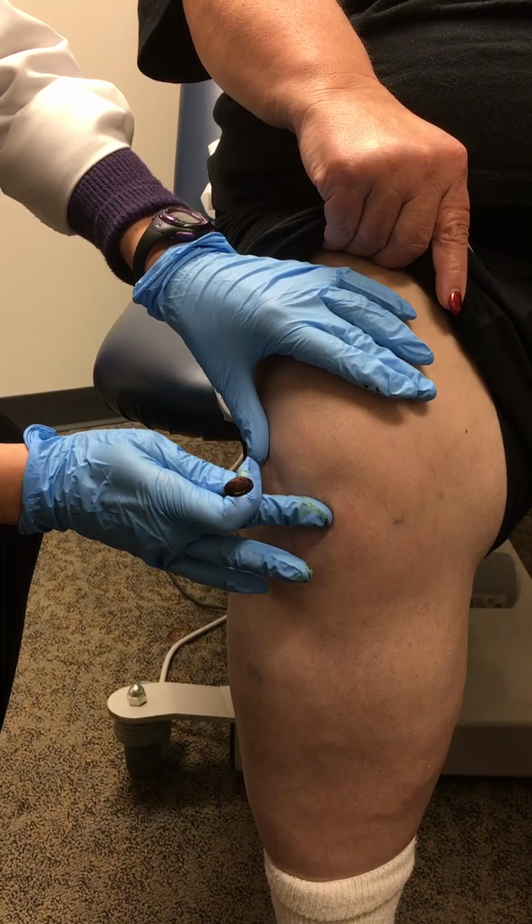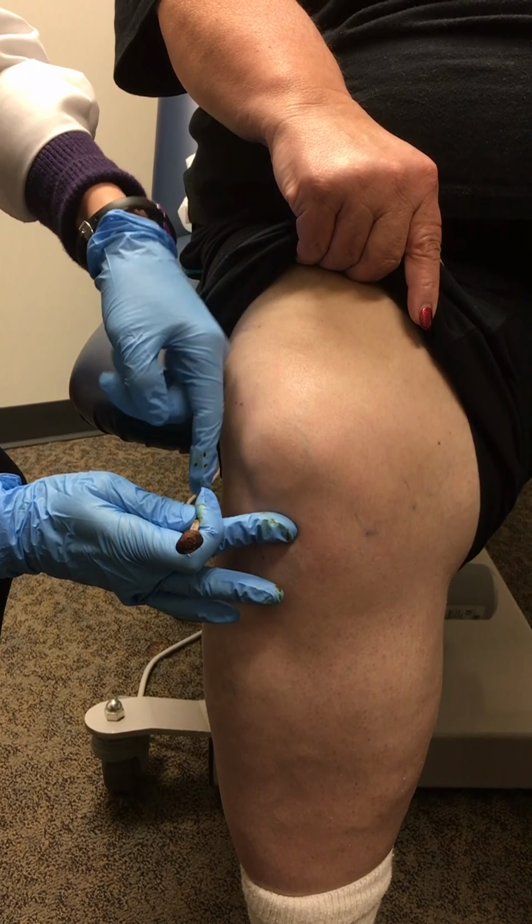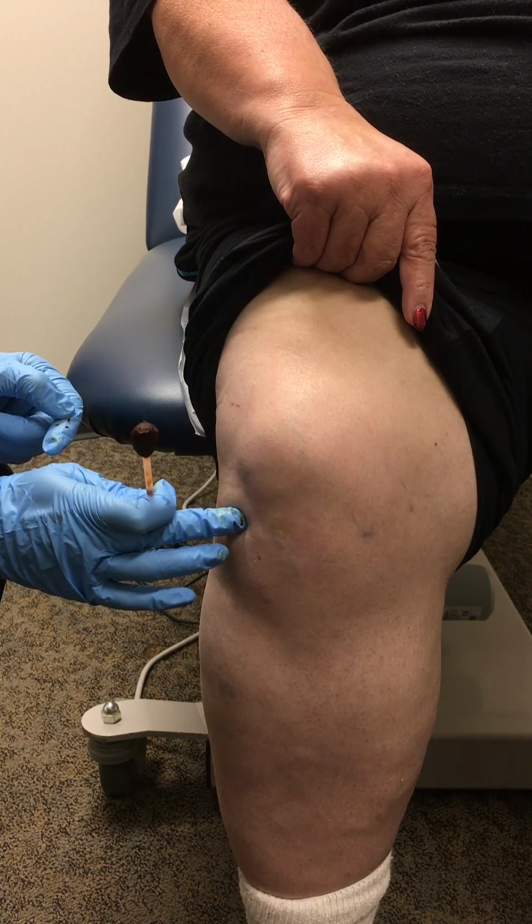And the next step is to find the landmarks on the patient's knee. So first I just feel the patella, and I feel the lateral edge, and then I also want to find the inferior aspect. And then I take where the lateral edge and the inferior aspect intersect. It's also where the little soft spot is.